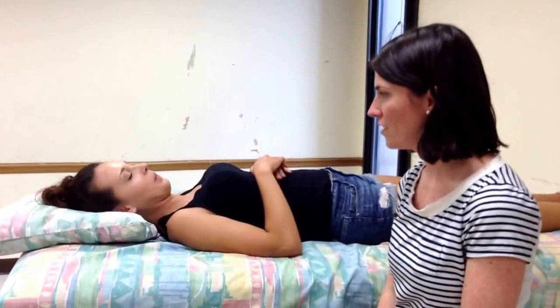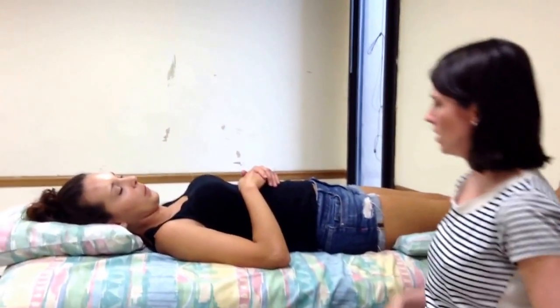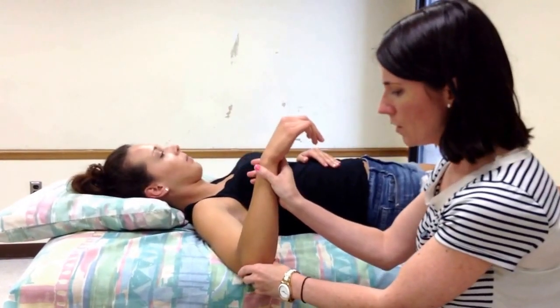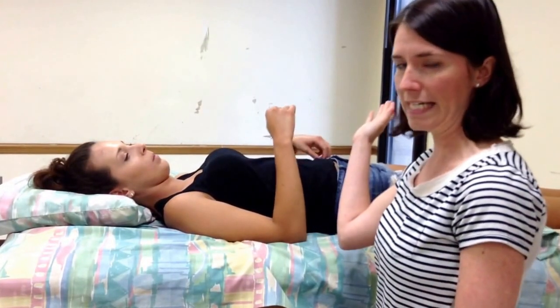We're going to measure shoulder internal and external rotation range of motion. In anatomic position, shoulder internal and external rotation occur in the transverse plane, but in our testing position, they're going to occur in the sagittal plane, and we're going to measure it in the sagittal plane. The end feel is firm. Normal value for shoulder external rotation is 90, and normal value for shoulder internal rotation is 70.